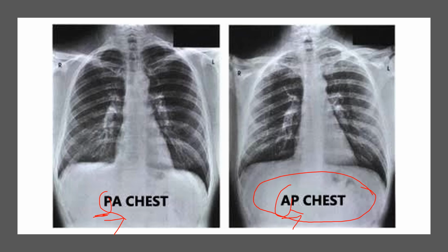If you go down to the X-ray or radiology and get an X-ray done where the cassette is on front of the patient, in other words, it's in front of their sternum, then it went from posterior to anterior. So wherever that cassette is ultimately what will tell you if it's an AP versus a PA. Where do the X-rays start? Do the X-rays start traveling through the body posteriorly to anteriorly?